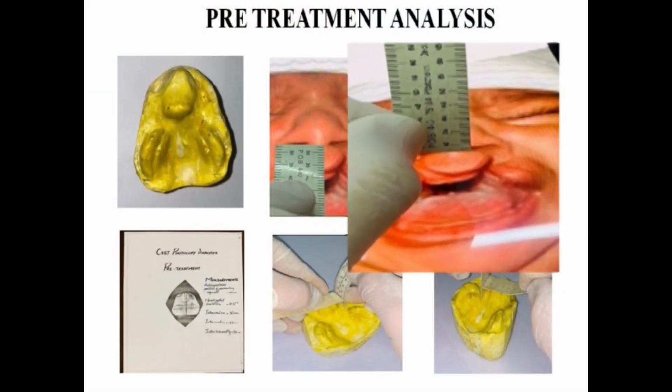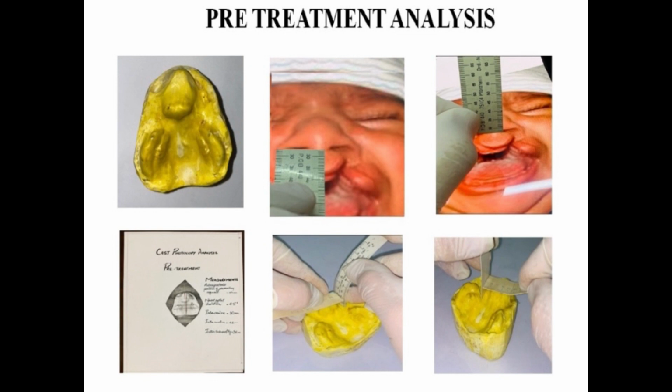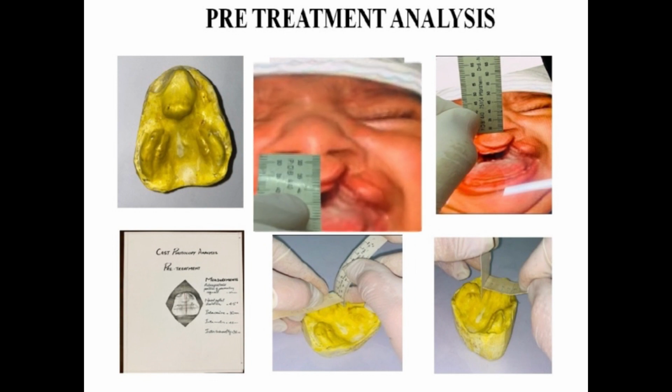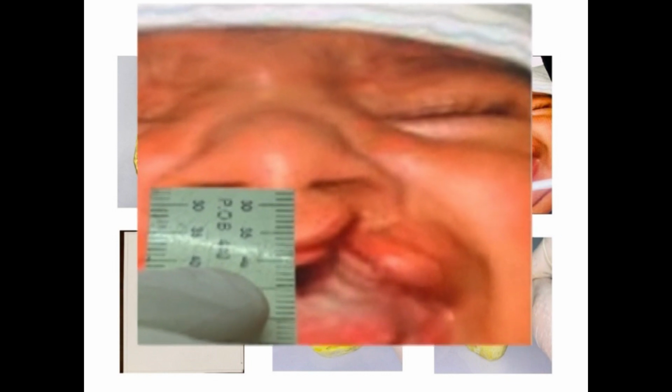2 anthropometric measurements are recorded on baby skin with a vinyl scale for columella and for prolabium length. The columellar length is measured from the base of the columella to the apex of the nostril, and prolabium length is measured from the base of the columella to the lower margin of the vermilion border. Results are based on the measurements from pre and post molding records and tabulated.